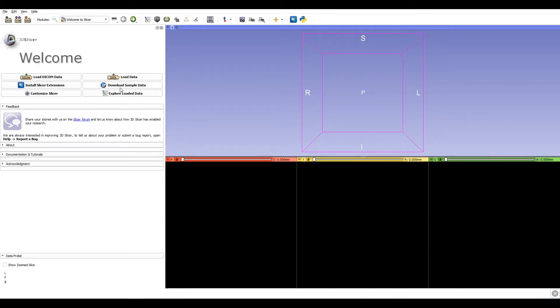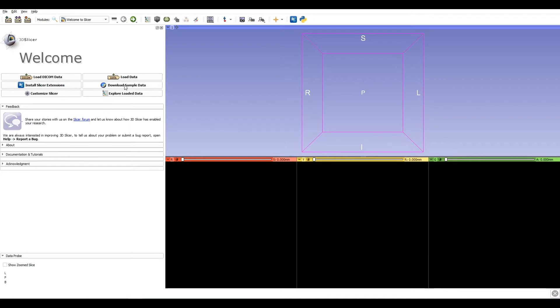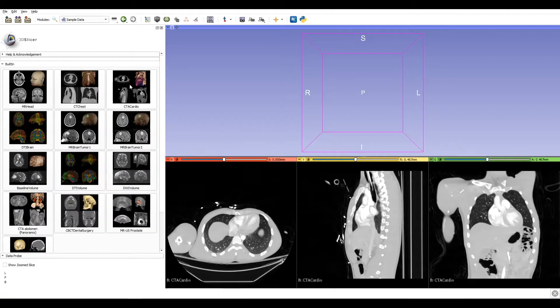Today we will start from a sample dataset. Click on download sample data and choose CTA cardio. This is the raw output of the medical scan.